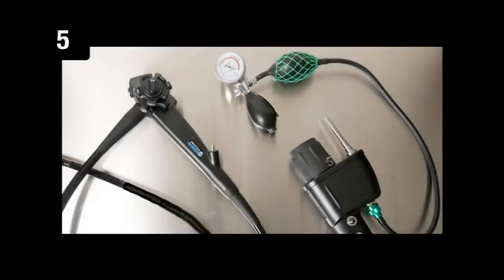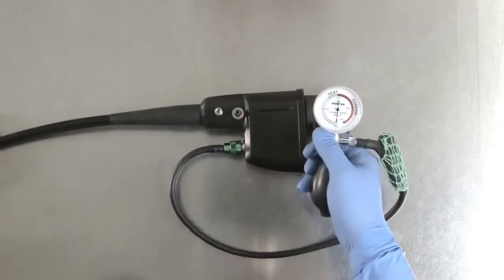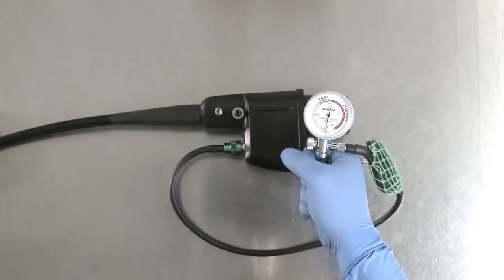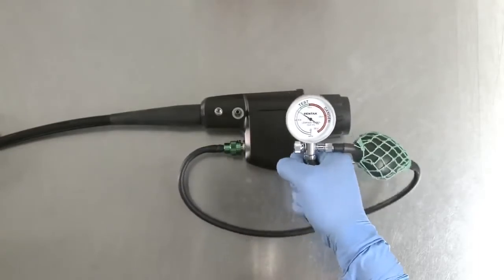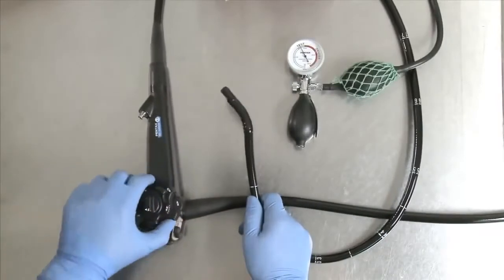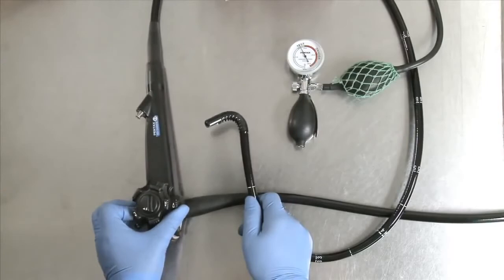Step 5: Perform the dry leak test. Attach the leakage tester to the venting connector and close the pressure relief valve. Pressurize the endoscope until the needle on the gauge moves into the green zone. Ensure that the control knob locks are in a free-moving position or unlocked and deflect the distal tip in all directions.